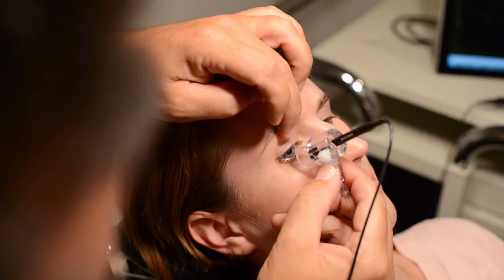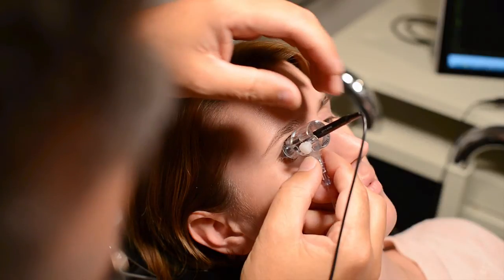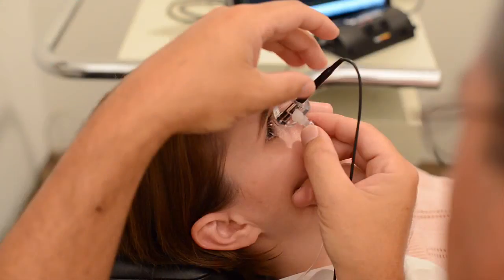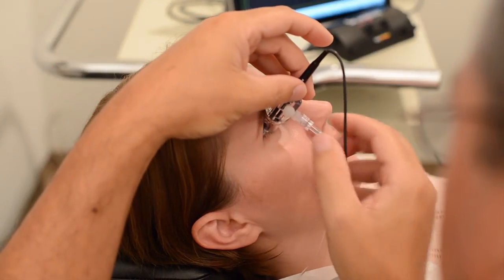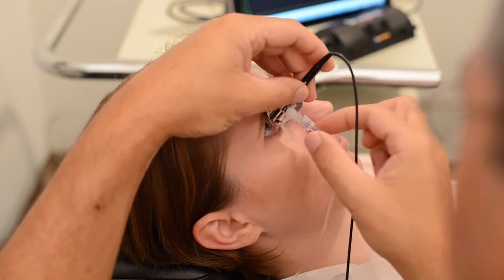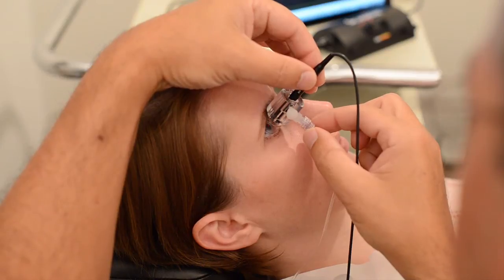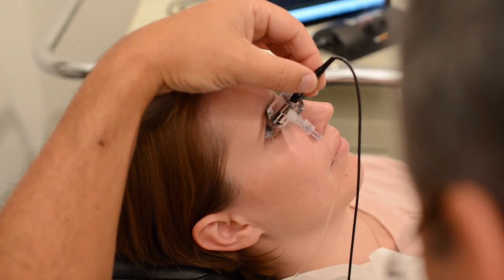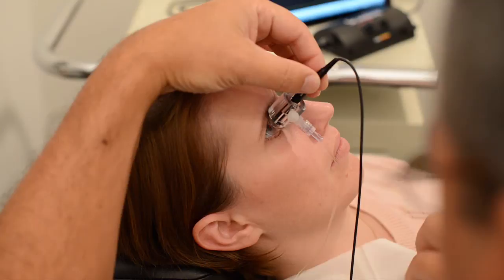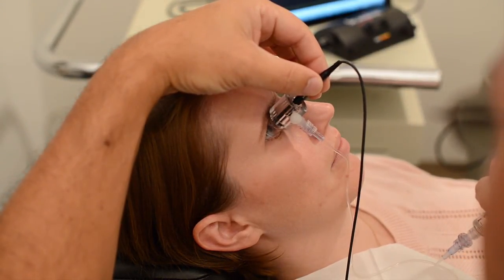Have the patient look downward. Lift their upper eyelid and insert the rim of the Prager shell underneath the lid. Then have the patient look straight ahead. Lift their lower eyelid and gently pivot the shell into position, centered around the limbus. This pivotal motion avoids contact with the cornea. You can rest your palm on their forehead to stabilize your hand and the probe. With your other hand, pick up the reservoir and slowly add saline to fill the shell.